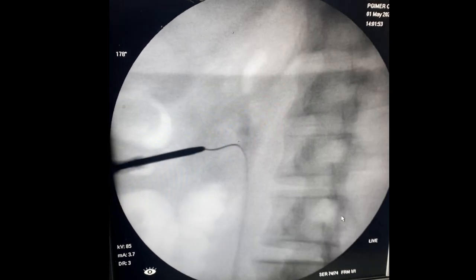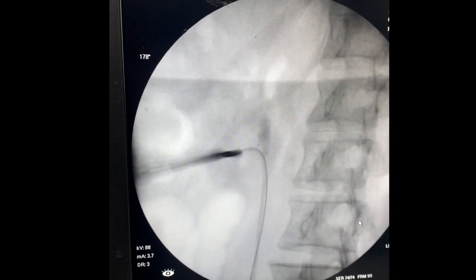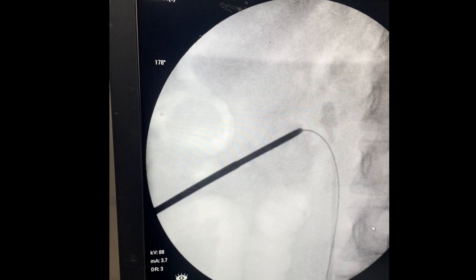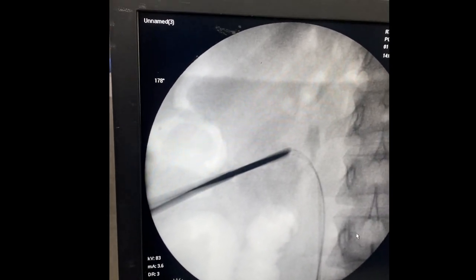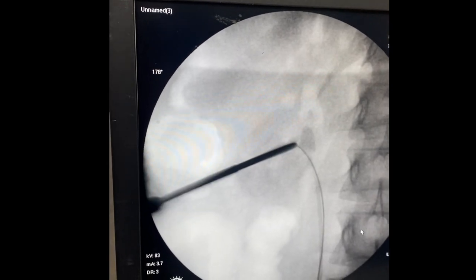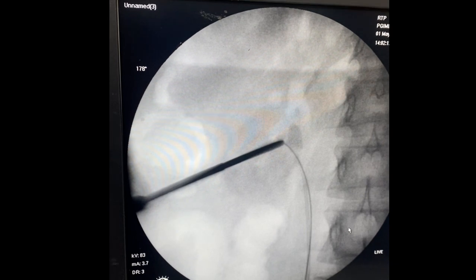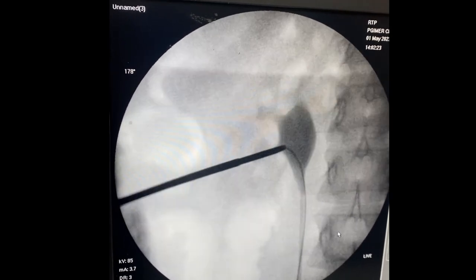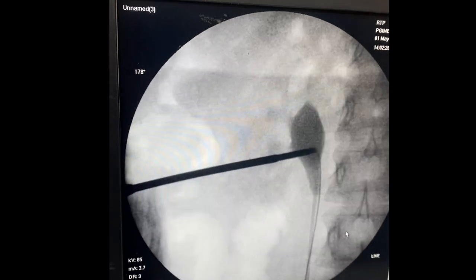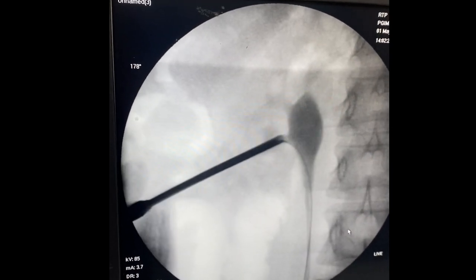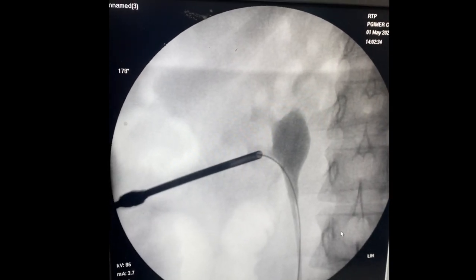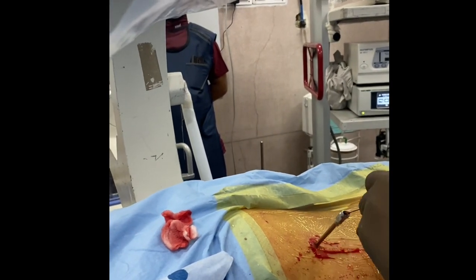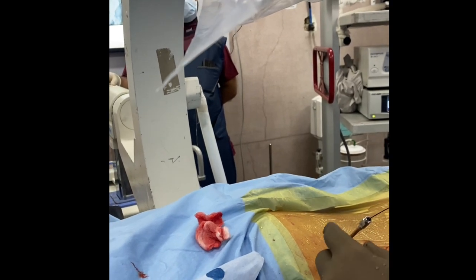Now I am passing the Alkan cannula. Whenever passing a rigid Alkan cannula, I always assess it at 30 degrees to understand the axis of the guide wire, then negotiate the cannula inside. Depth is assessed at 0 degrees. The tip of the Alkan cannula has almost reached the pelvis. My assistant injects contrast — I try to keep the dilator just in the calyx, though in this case it is placed inside the pelvis. The outer cannula is then passed inside and the Alkan cannula removed. Always confirm again whether free flow of saline is present, which confirms correct placement.